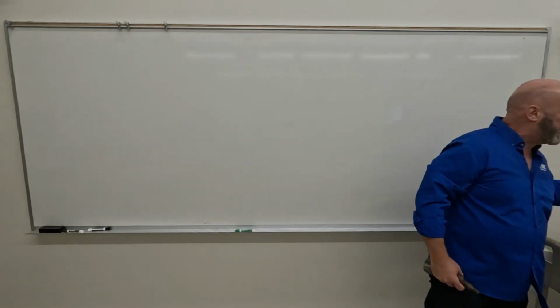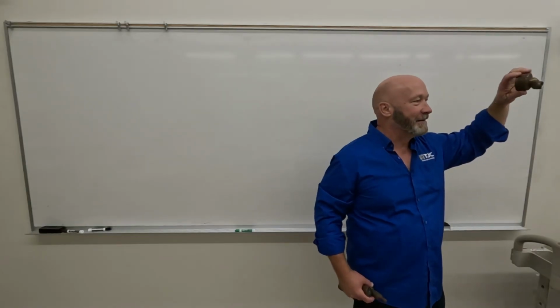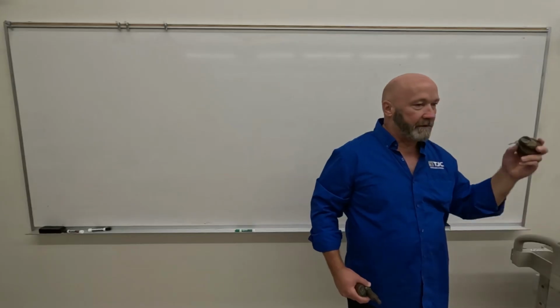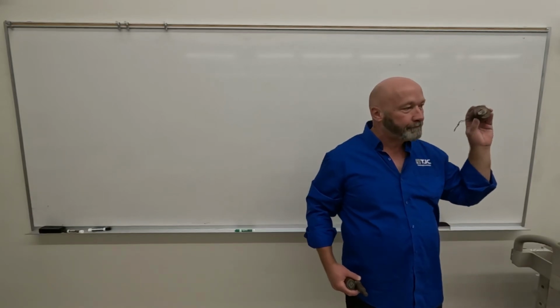So the opposite end of the anode, the cathode end of the X-ray tube, is what this is. So this is it, the entire cathode. Yeah, I'm glad I have an X-ray tube. So this is the cathode end of the X-ray tube.